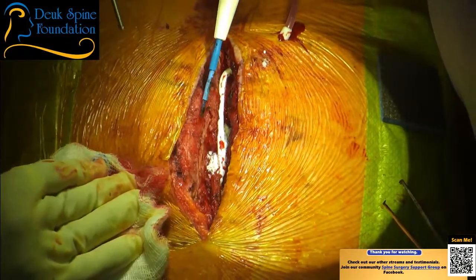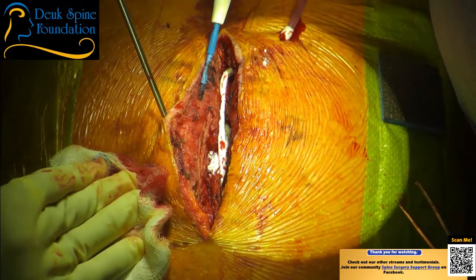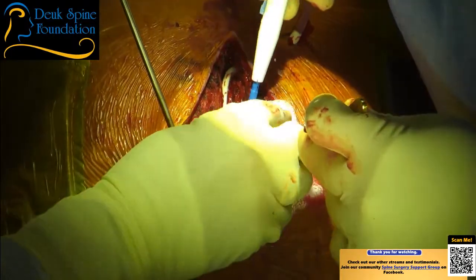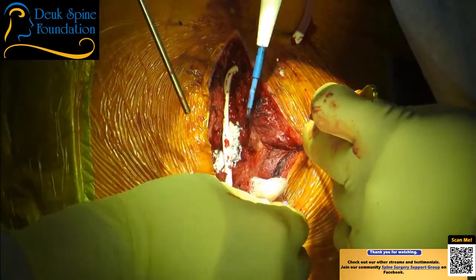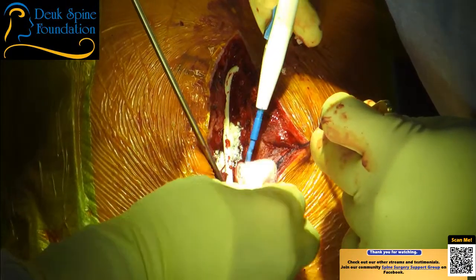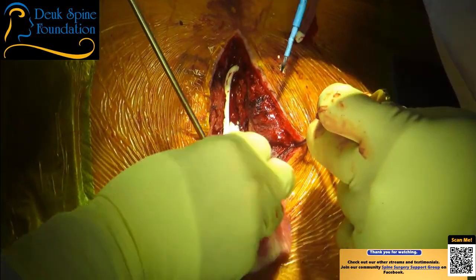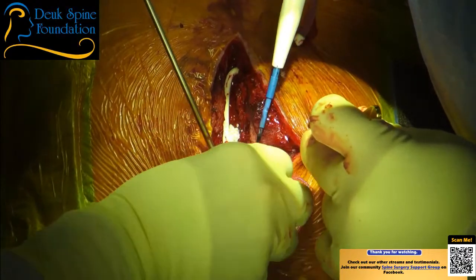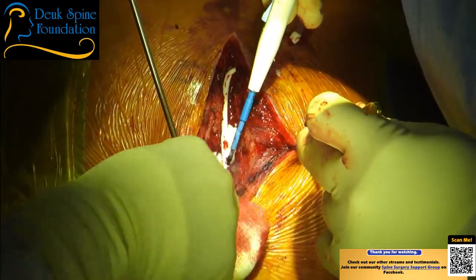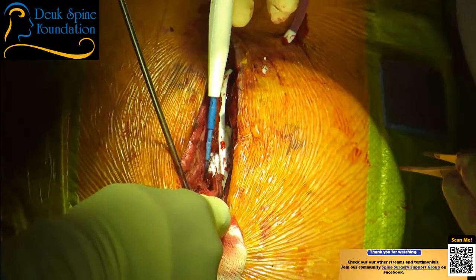Something isn't right. You're sure about that blood pressure reading? Get down there. Did you cook these enough when you came in? If you don't cook them enough, then you're going to have bleeding on the way out. You're sure, right? All right. You're getting muscle contraction, which is good. Gentle, gentle. Don't wipe blood. See, there's another one.